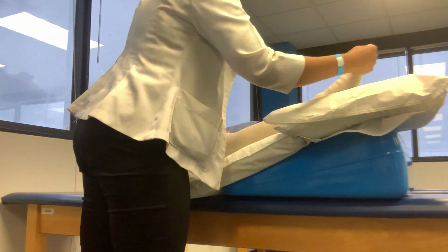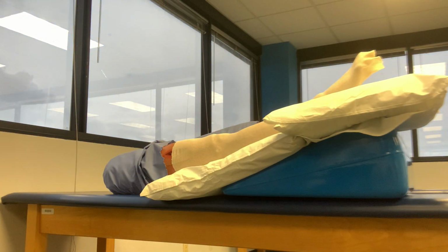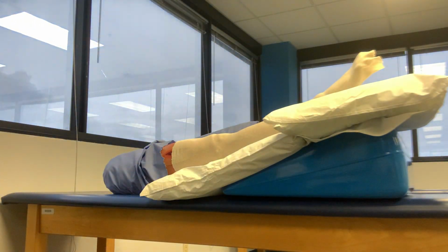So once I've applied my stockinette, then I can get my sleeve. So since I'm treating the lower extremity, I have to have the lower extremity sleeve, and then also the type of machine that I'm using, I would need to have the single chamber machine.